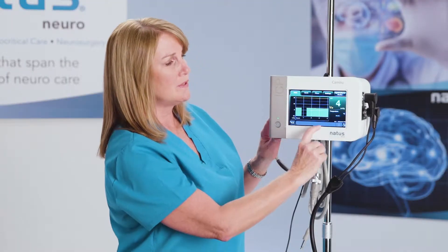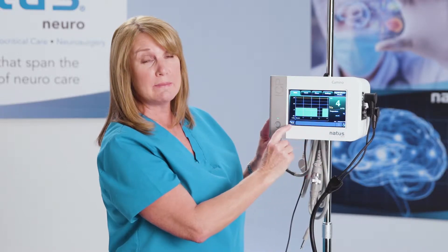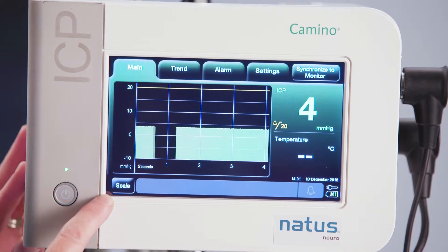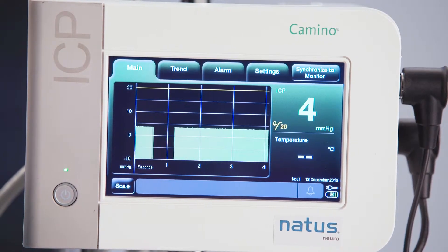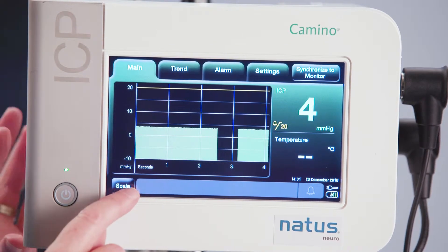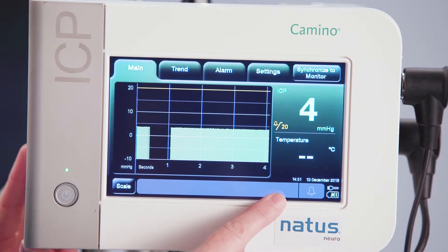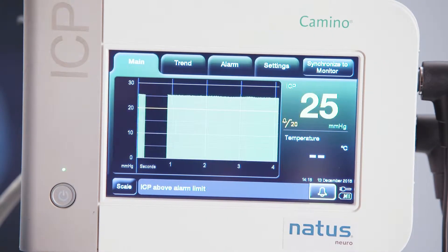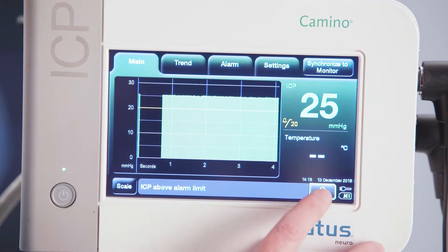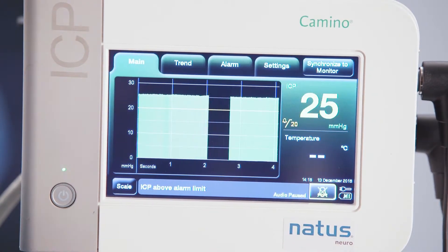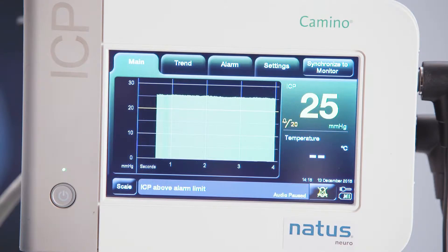At the bottom of the screen, you'll see a gray message bar. Anytime the monitor wants to tell you something about itself, the catheter, or the patient, it will pop up with a message down here in this bar. If it's a message that you need to intervene on — something that's important for the patient — then it will flash bright yellow and also sound an audible tone, so you'll know that you need to go and address something with the monitor or the patient.